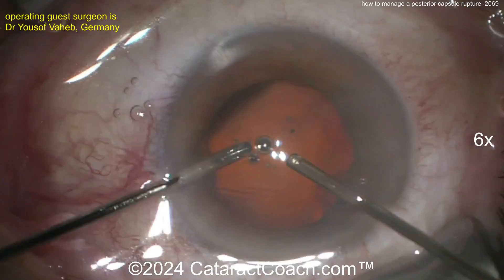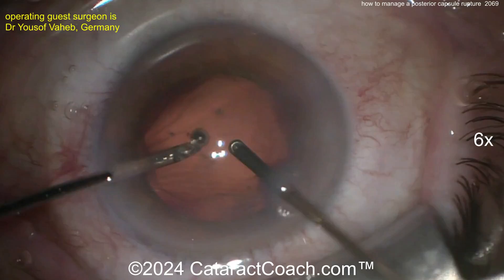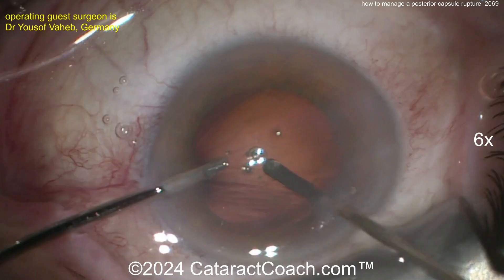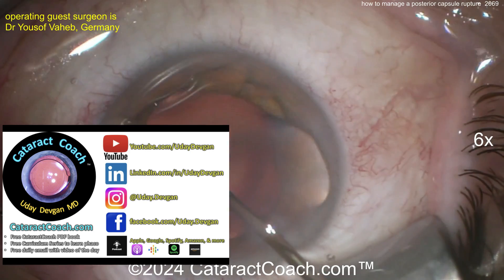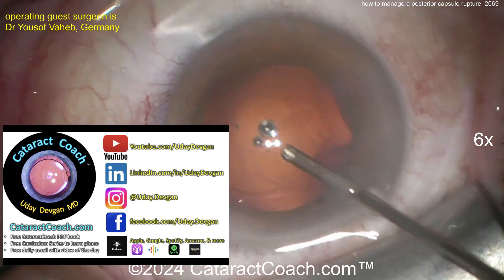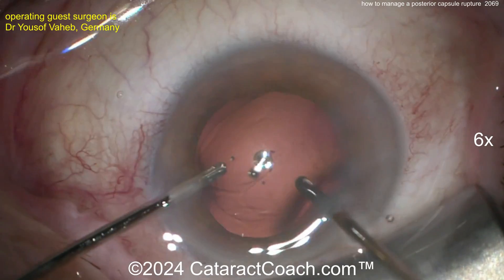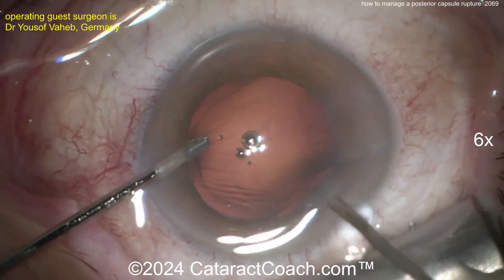If you run into tiny lens fragments like that, take them down with the vitrector. Make sure you know the difference in the settings — what's I&A cut versus anterior vitrectomy? You need to know the difference. We have a whole free book on cataractcoach.com about learning cataract surgery, including anterior vitrectomy, with a full curriculum of lessons.